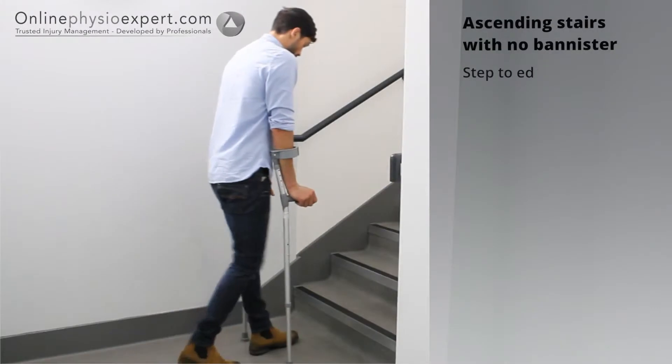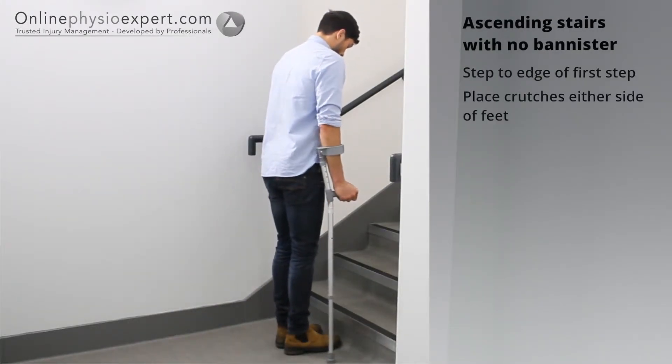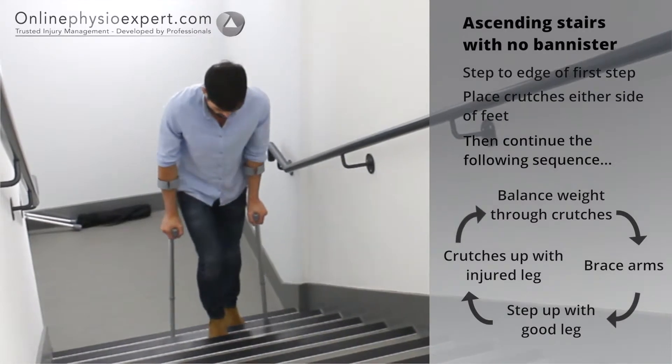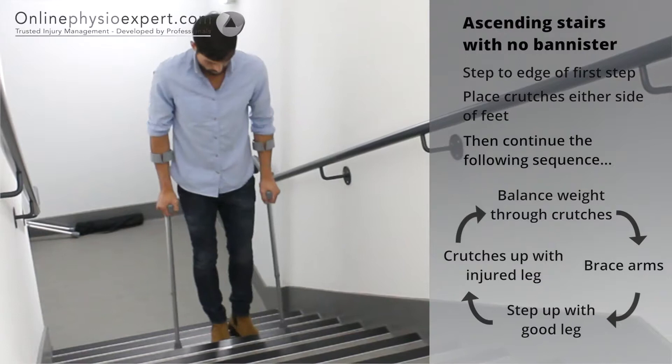To ascend stairs with no banister, step your feet to the edge of the first step. Balance through your crutches and step your non-injured foot to the next step. Bring the crutches up with your injured foot last. Repeat these sequence of movements until you safely reach the landing.